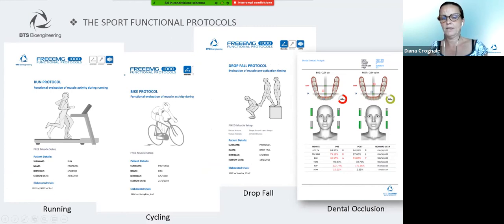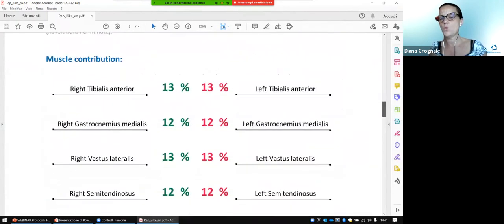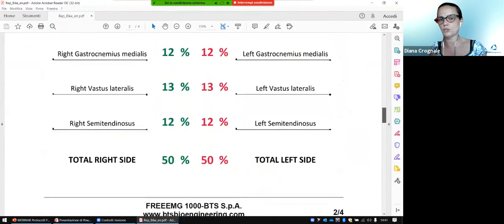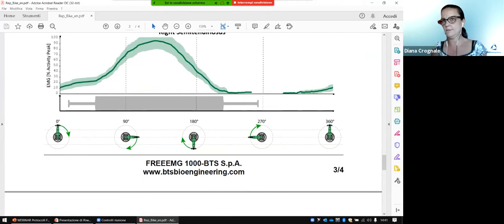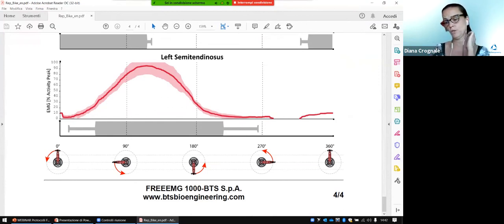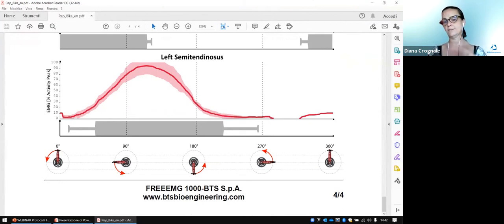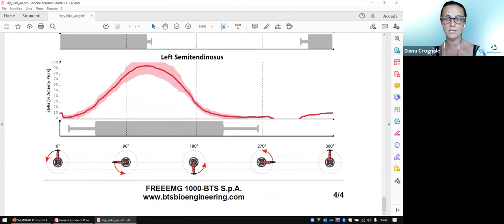You can see immediately in the cycling protocol that the layout of the report is exactly the same — with the contribution in terms of percentage of each muscle, and also the coordination behavior within the cycling cycle for the right side and also for the left side. The horizontal band identifies the correct timing of activation, and it's important that the subject performs this test maintaining 80 to 100 RPM. So the velocity with which the subject is cycling is very important.